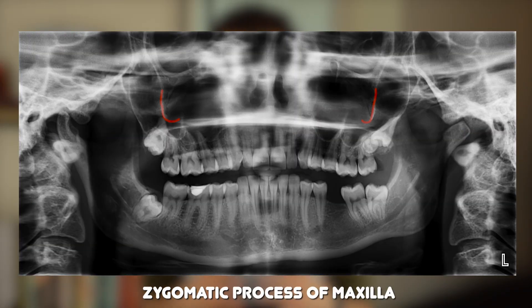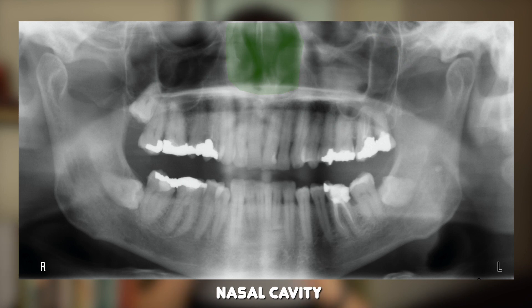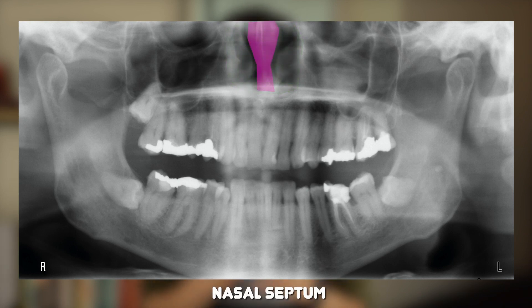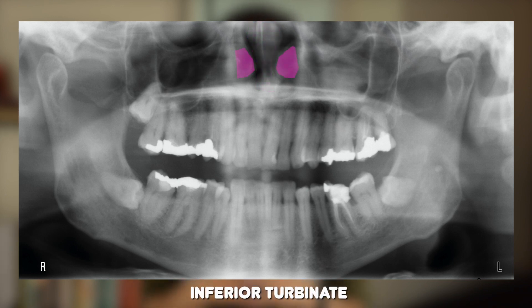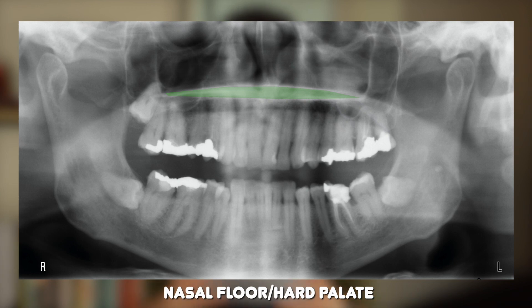We can also see the zygomatic process of the maxilla, or the malar buttress, which usually appears as a U, V or J shaped radio-opaque area around the first or second maxillary molars — this is why these teeth can be difficult to extract, as the bone is quite dense in this region. The borders of the nasal cavity can be seen as radio-opaque lines medial to the maxillary sinus. Within the nasal cavity we can also see the nasal septum as a radio-opaque area at the centre of the panoramic film, and potentially the inferior nasal turbinate as a round or curved radio-opaque mass. The floor of the nasal cavity, or the hard palate, is present as a thin radio-opaque line, which may be superimposed over the maxillary sinus or maxillary teeth.